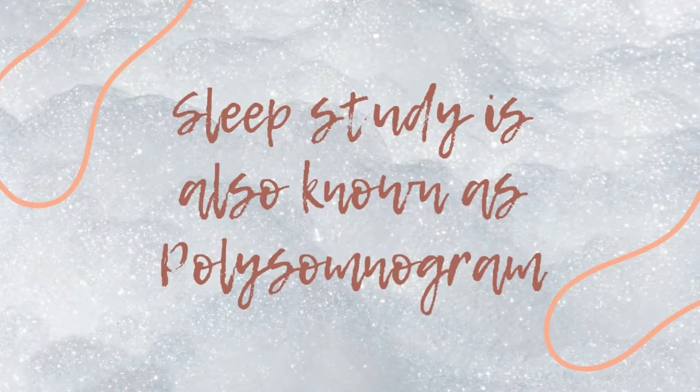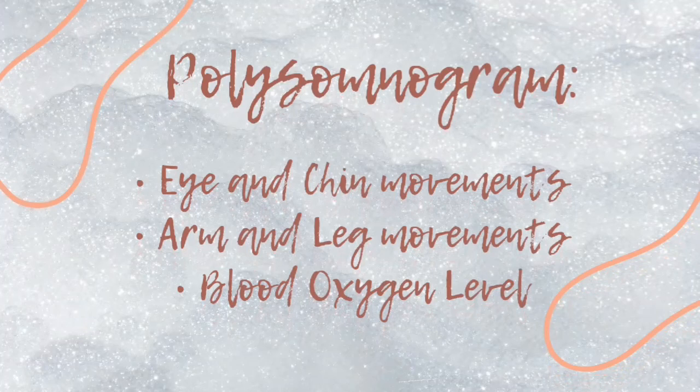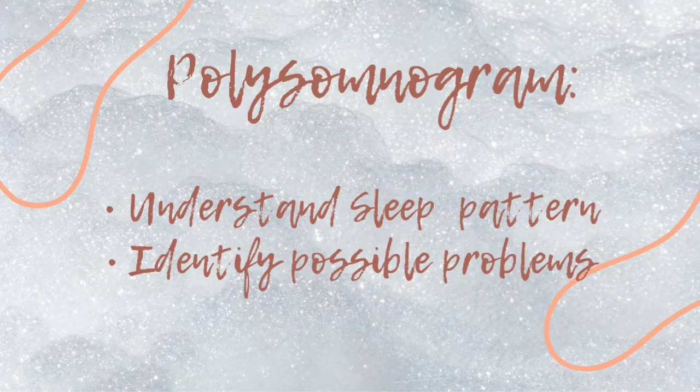A sleep study is also known as a polysomnogram. A polysomnogram records your brain waves, heart rate, and breathing. It will chart eye and chin movements, arm and leg movements, and blood oxygen level. All of this data will help the doctor understand your sleeping pattern and check what the underlying problem is.